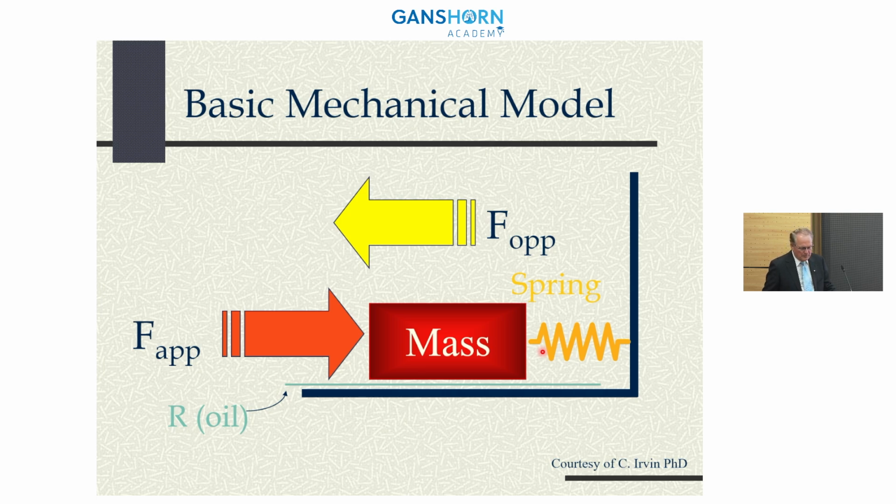So when we look at respiratory oscillometry, it requires an understanding of the basic kinetics that take place in the lungs. And whenever we are using a mass, whether that mass be a solid, a liquid, or a gas, it requires the application of force, but there are also other things in play. There are restrictive or resistive properties.